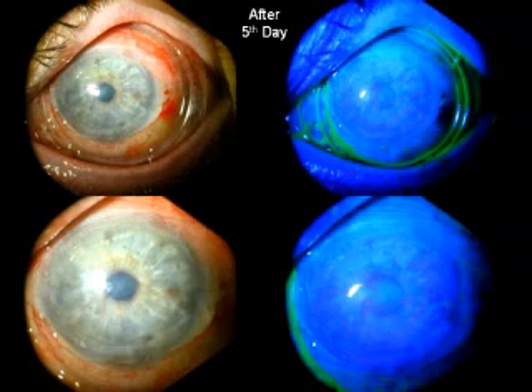And then five days later, as you can see, this patient's eye had good healing using fluorescein staining without removing the procura. And after removal of the procura, you can see the healing of the corneal epithelium following this treatment.